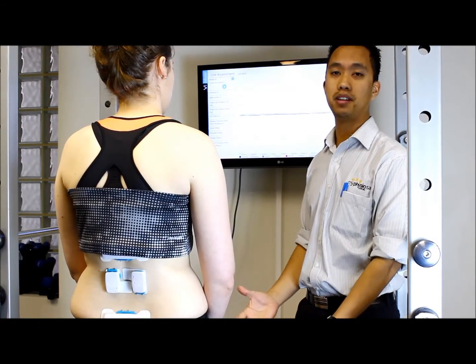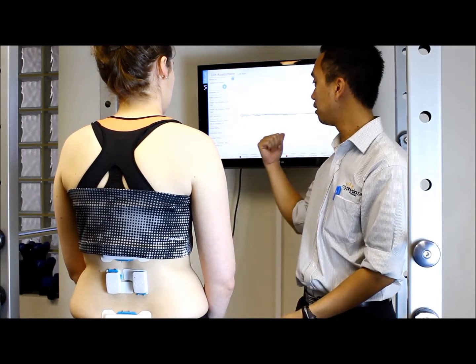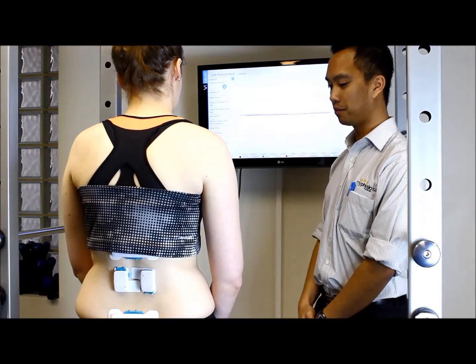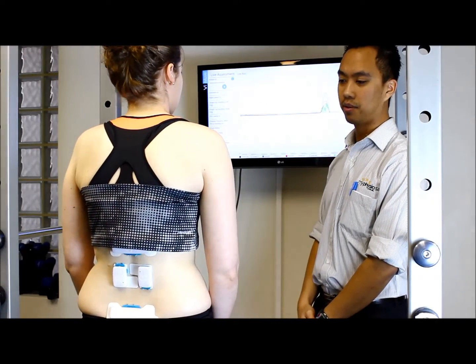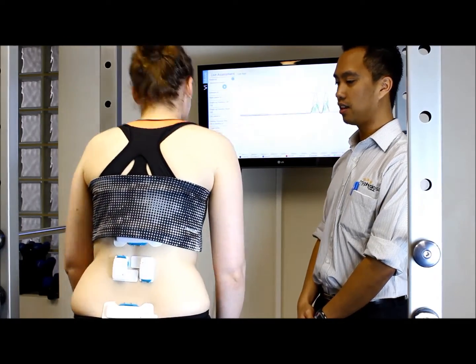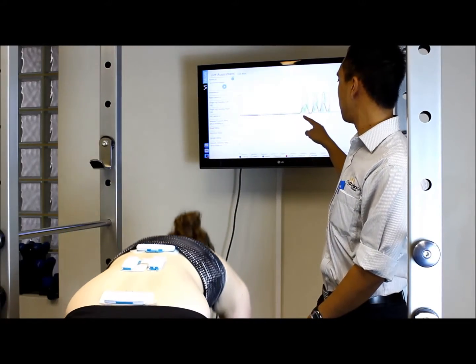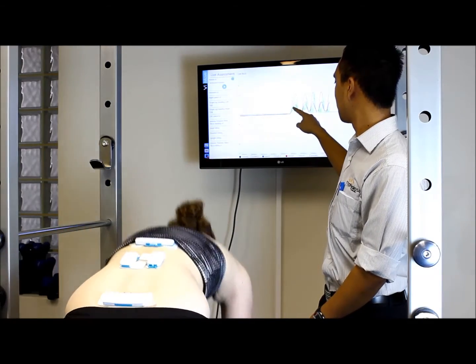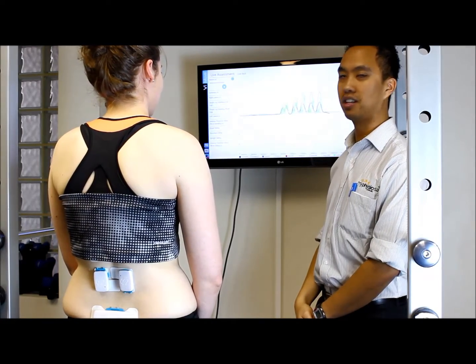With the live assessment here in the clinic, the information from the sensors can be displayed on our TV screen. If I get our model to bend forward and then backwards, repeating that a couple of times, we can see on the TV screen the amount of movement happening at the top of the back, at the pelvis, and this green line shows how much muscle activity is going on with the muscles in the back.